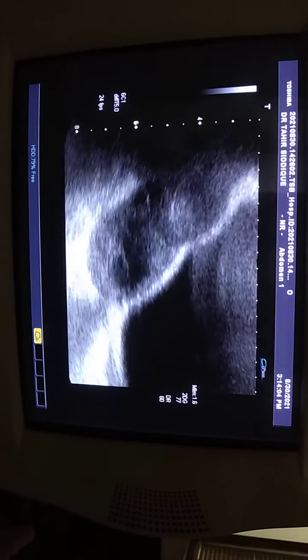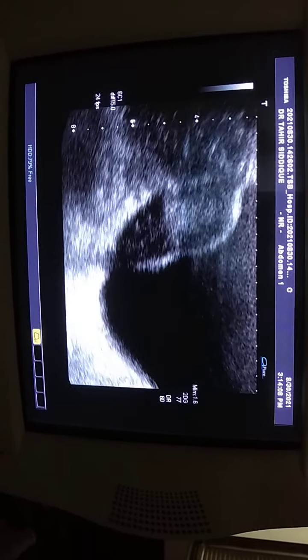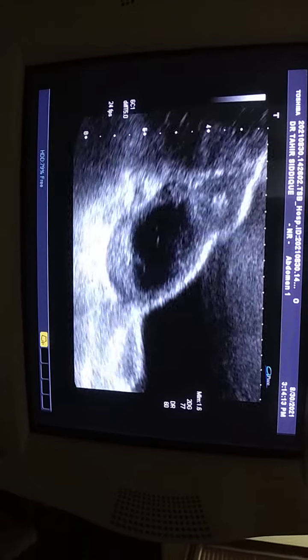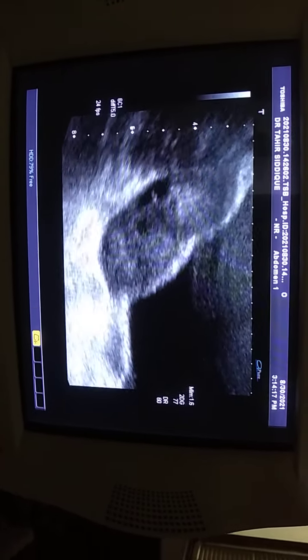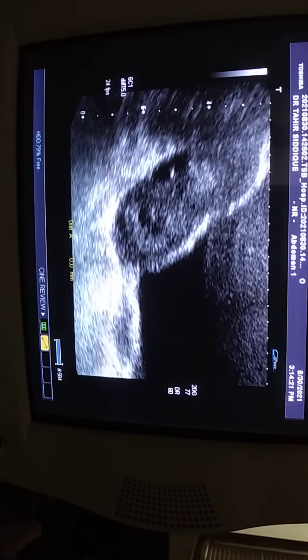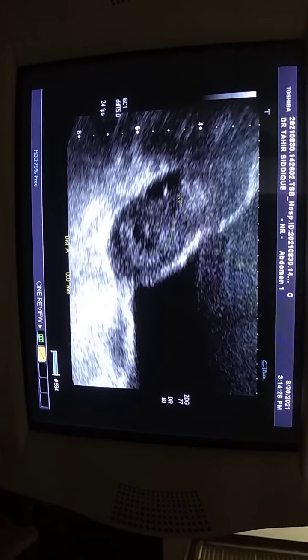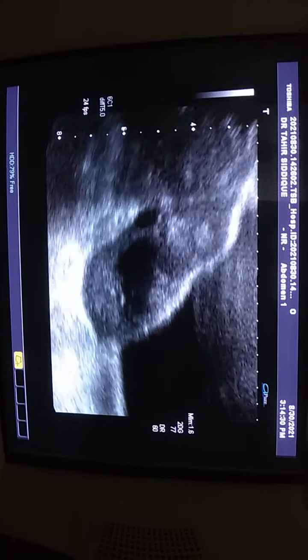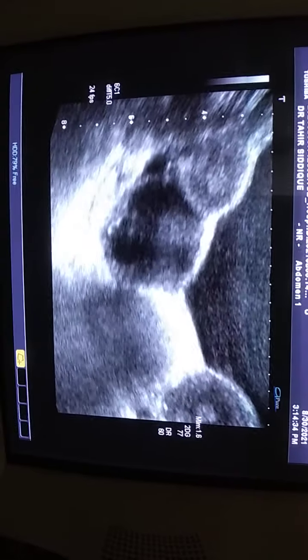right-sided, and we cannot get it through to the, it is separated from the cervix and the vagina. As you see, this is the vagina, and this is the uterine body that we measured and seen, and this is all bleed in the body of the right-sided uterus. This is a case of uterus didelphys.